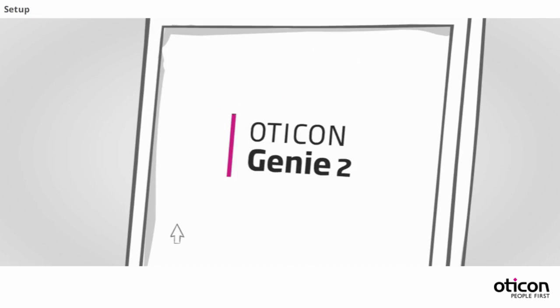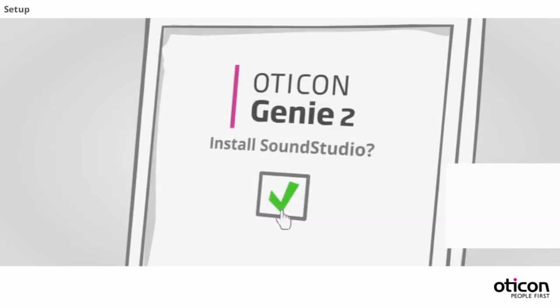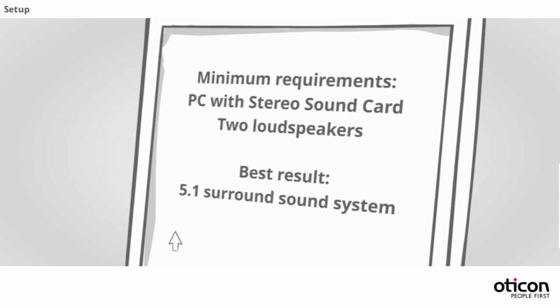SoundStudio is delivered with your Genie 2 fitting software package and will be installed together with Genie 2. The installer will ask you to allow the installation of SoundStudio on your PC. As a minimum, SoundStudio needs a PC with a stereo sound card and 2 loudspeakers to work. To get the best result, we recommend using a 5.1 surround sound system with 5 loudspeakers.